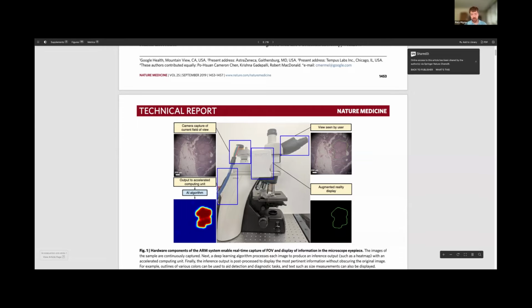It still requires you to provide some labels. But the advantage of this approach is that when you want to build a model, a lot of the learning is already done. So rather than requiring thousands and thousands of labeled patches to build, say, a prostate cancer model or a mitotic count model, you may only need a few hundred. It's a hugely reduced amount of data compared to before, and this is general across tasks. Because it's trained within the H&E domain, you don't need the thousands of patches that we've needed before. The model is doing a lot of the work for you, but there's still a little bit of work for you to do. At the end, you have a model that works for whatever task you're curious about in the H&E sphere.